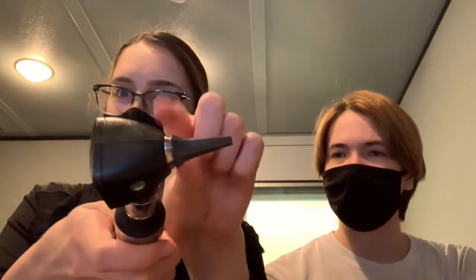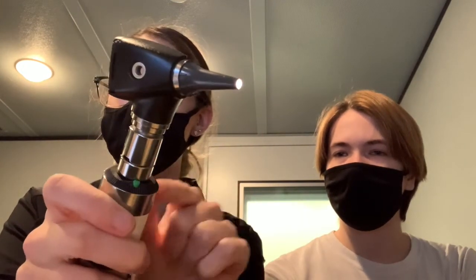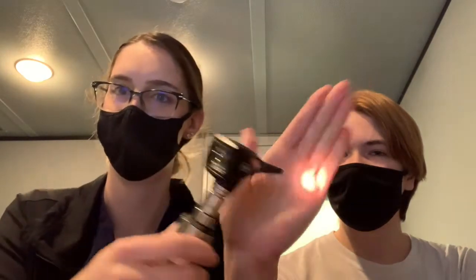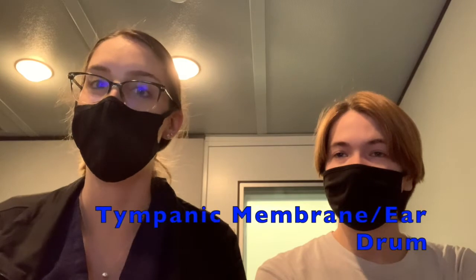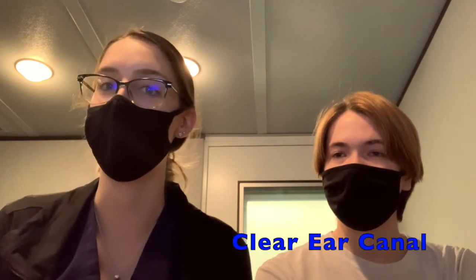So to put the tip on, you're going to want to screw it and you'll feel a little click. And then to turn on the light, you just move this green button across and you see the light. All right. So when looking inside the individual's ear, you're looking for the tympanic membrane, which is also the eardrum, and you're looking to make sure that the ear canal is all clear, that there's nothing occluding it or blocking you from visualizing the tympanic membrane.